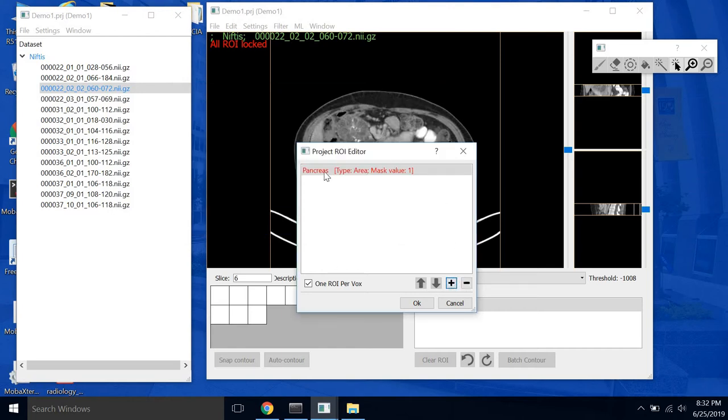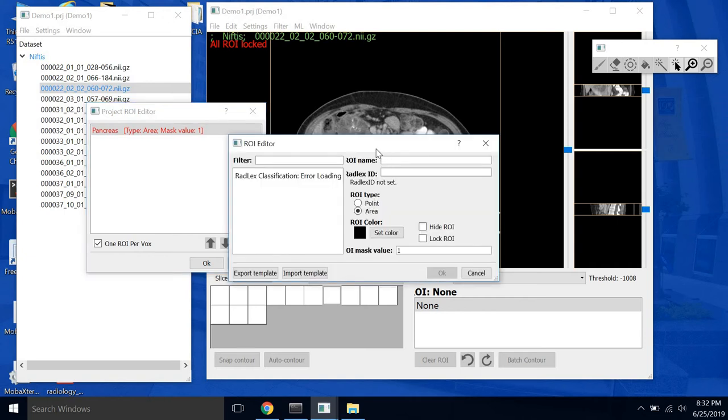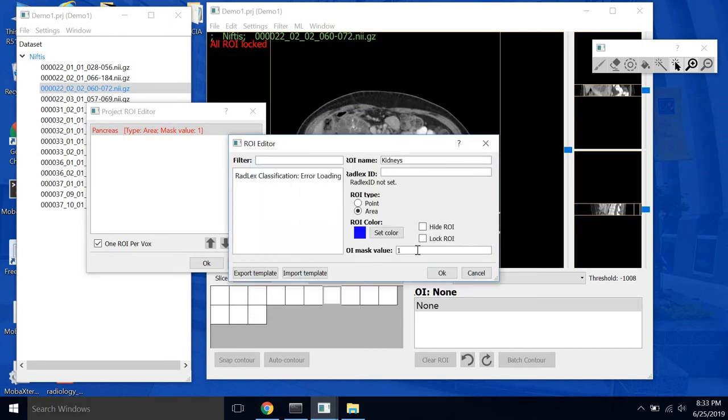And then what else is in this scan? Kidneys. We can see the kidneys pretty clearly. So we'll create an ROI for the kidneys. We'll make them blue, and we'll change this value to 2.